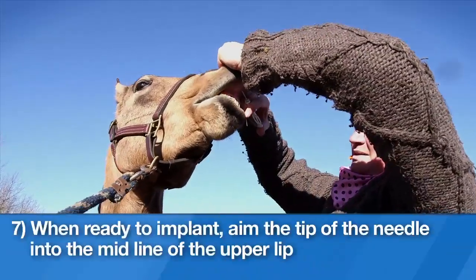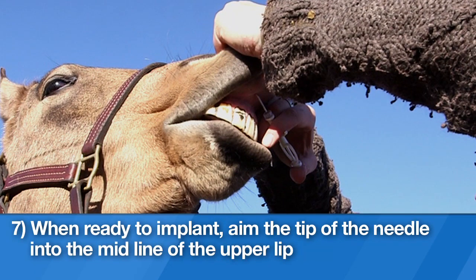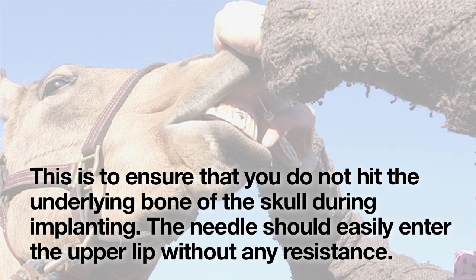7. When ready to implant, aim the tip of the needle into the midline of the upper lip. Note: the angle of the syringe should be slightly greater than the angle of the upper incisors. This is to ensure that you do not hit the underlying bone of the skull during implanting. The needle should easily enter the upper lip without any resistance.